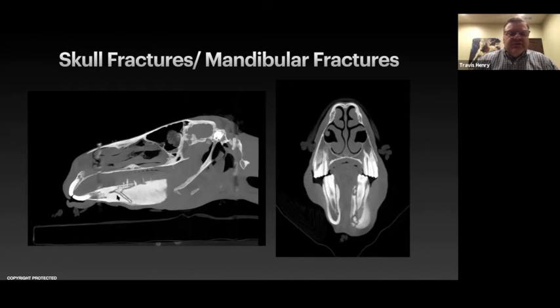The interesting thing on the CT was that this horse looks a lot like that other horse, Coda, that we showed before, and I'm not disputing that one could have started with trauma as well. But this horse really didn't have periodontal disease to speak of in her history, and we had performed the dentistry on her for years. So this one, we had an inciting cause. The owner had noted she'd come in painful from the pasture. It was also cultured, and we had a very aggressive bacteria. I can't remember which one. It wasn't an actino on this horse, but it was only sensitive to chloramphenicol. So we put this horse on chloramphenicol. Once we saw that this was bridged with a nice callus, we extracted the tooth that was in the draining tract primarily, and the draining tract healed up within 5 days after that.